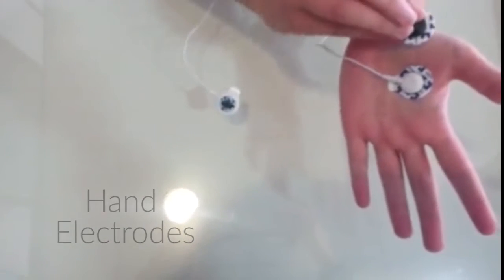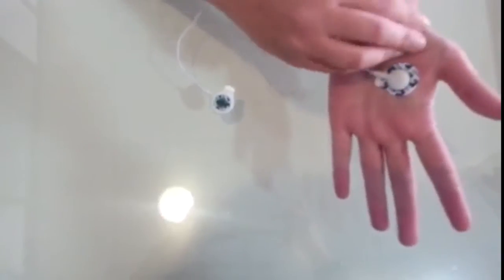Hand electrodes: place the negative and ground electrodes on your right hand, as you see in the video. Then place the positive electrode on your left hand.